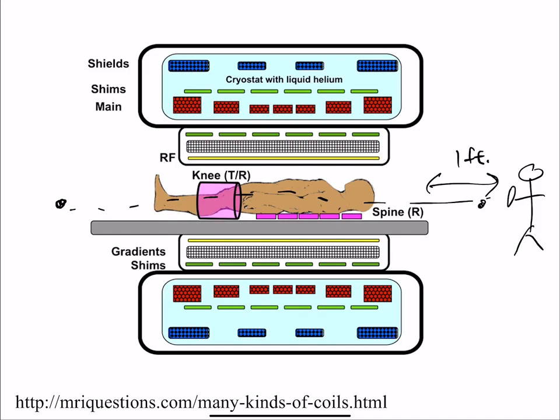Yeah. Right. And if you're not exactly in the center, then it's going to go... So if you're perfectly in the center, it's going to go, you know, and then just... But eventually it's going to hit something. Yeah, so you don't want to be the one to do that experiment. Although, the only time you're allowed to do this experiment is when you're getting rid of your magnet.